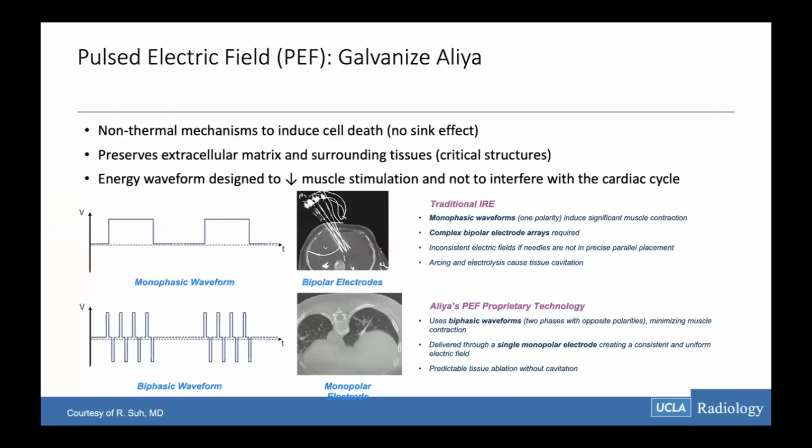This is a newer technology. Pulsed electric field is basically monopolar. The previous one was bipolar. This one is a monopolar IRE, which is a new technology, and we are testing it. And this may potentially introduce more treatment benefit for some of our patients.